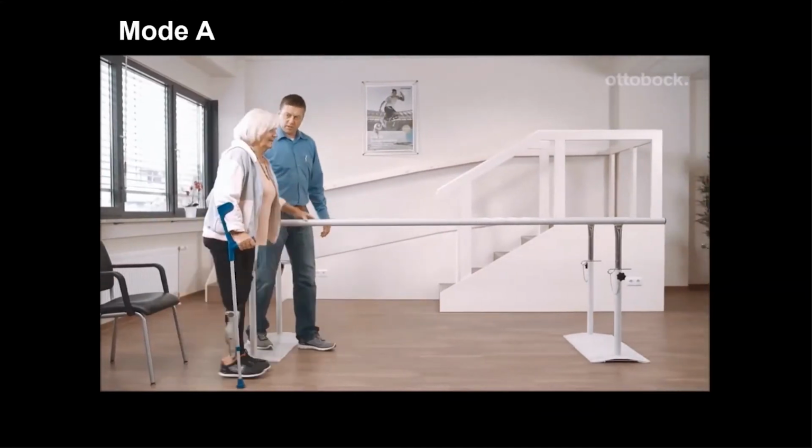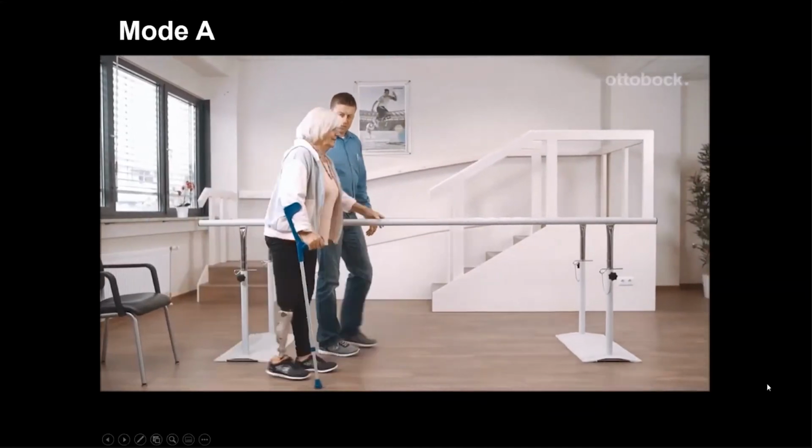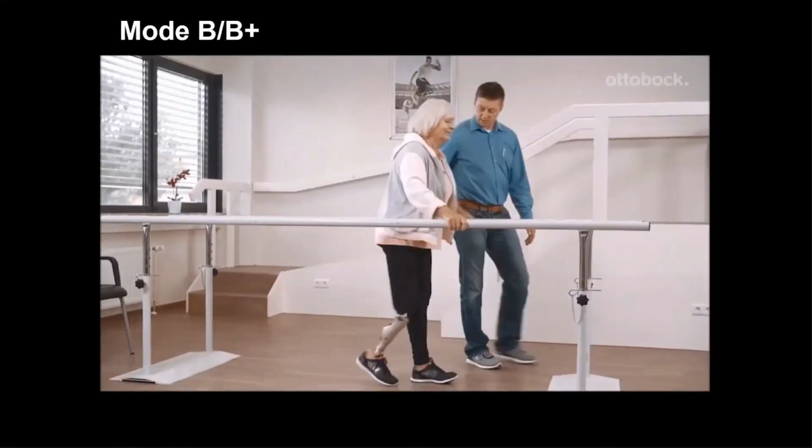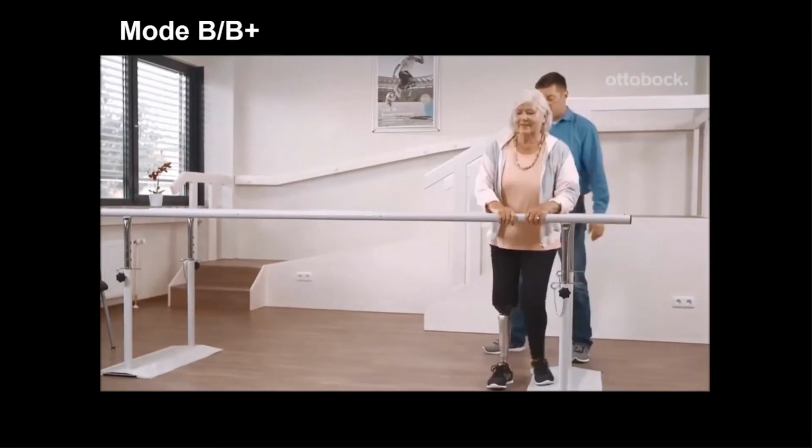Then as they progress, next slide, Dr. Kannenberg, we can move into the mode B plus. So now it will be locked in stance phase and release in swing phase.